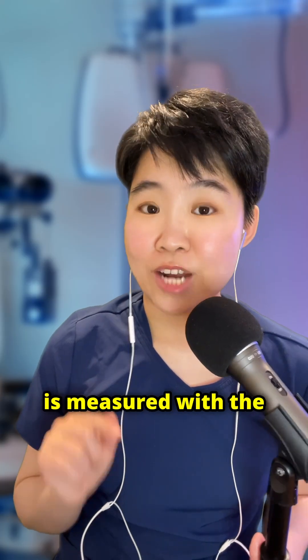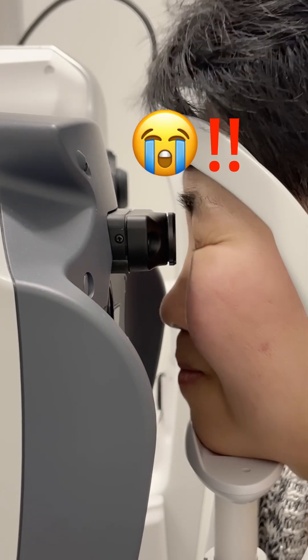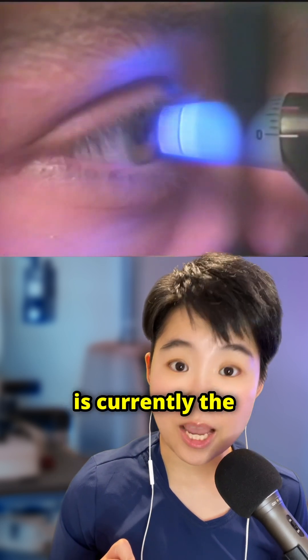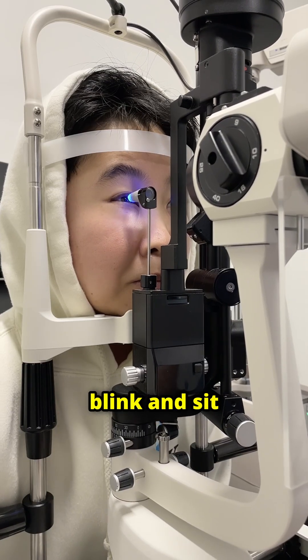Traditionally, eye pressure is measured with the infamous puff of air, or with a probe that touches your eye. This probe method is currently the gold standard. It requires the use of a numbing drop, and it requires patients to not blink and sit still.